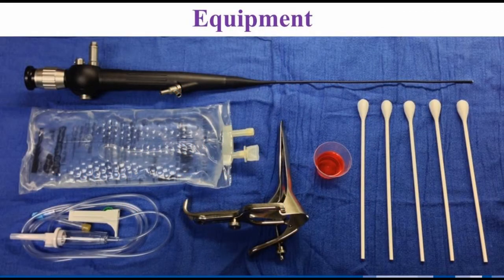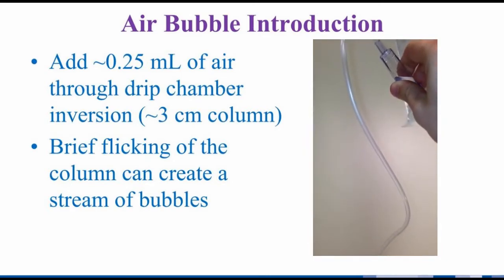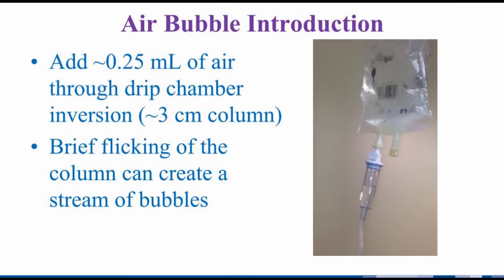Apart from the 2.5 mm flexible pediatric hysteroscope and associated equipment, the technique needs the minimal supplies of saline and IV tubing. While a speculum, chlorhexidine, and swabs can also be used, a vaginoscopic approach without them is also possible. We briefly invert the IV tubing drip chamber to introduce approximately one-quarter of a milliliter of air. For us, this is approximately a three-centimeter column. With a slower rate of flow, the column may need to be inverted longer.